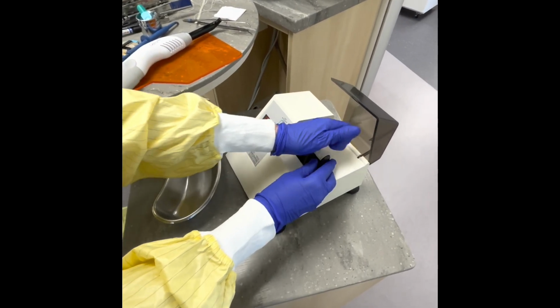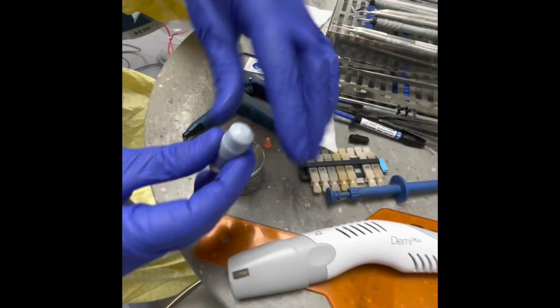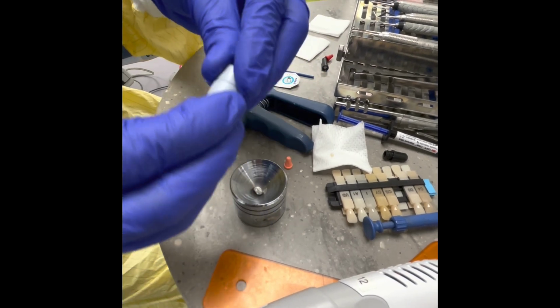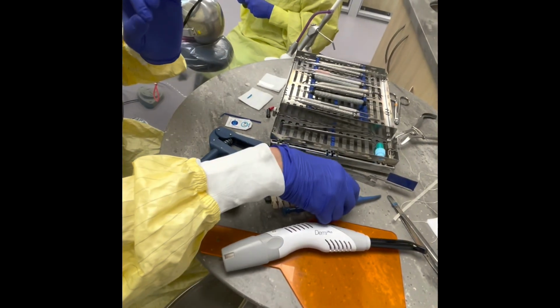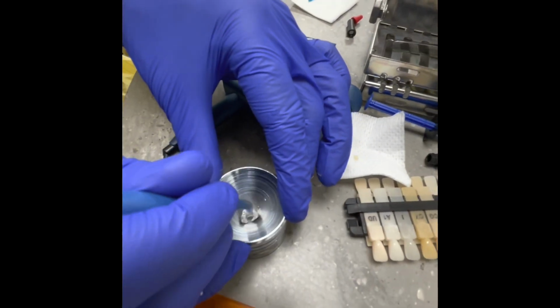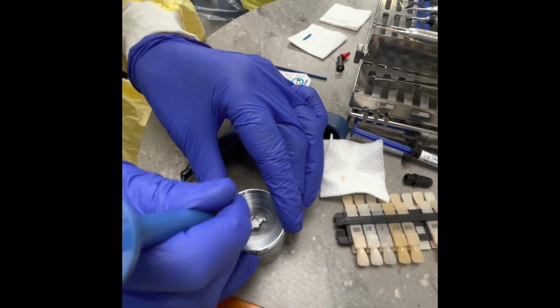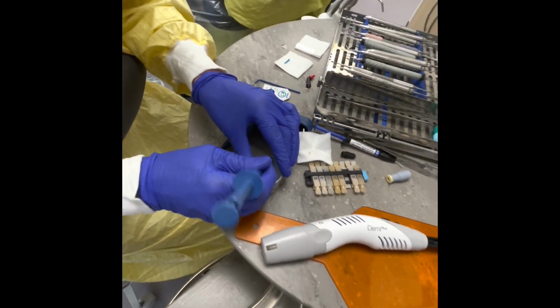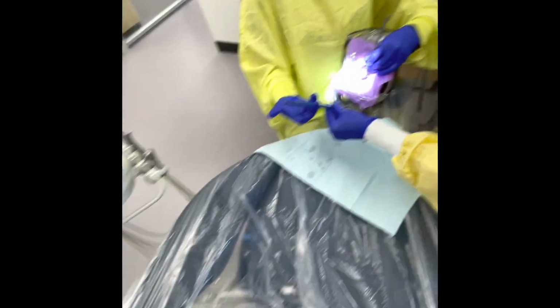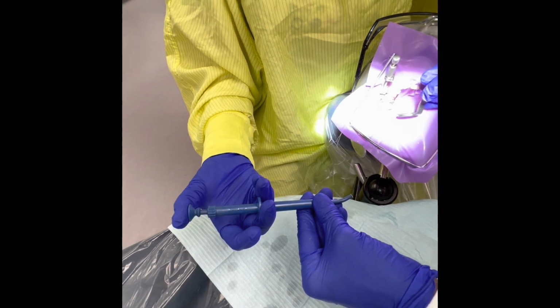Sometimes they are a struggle to get out of the amalgamator. Then you just have to open it like so and dump it into this little well. Then I have my amalgam carrier. I'm just going to squish it down into that amalgam. I think Shannon Cowan would have taught you this. And I'm going to pass it to Amanda. So the transfer for this is she's going to transfer it into my hand like this, okay? So that I can hold this carrier correctly.